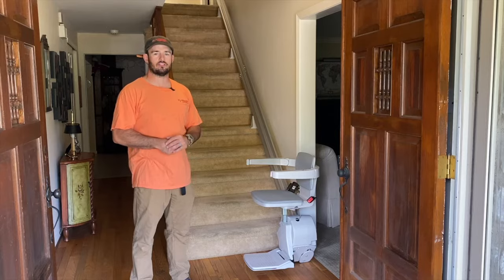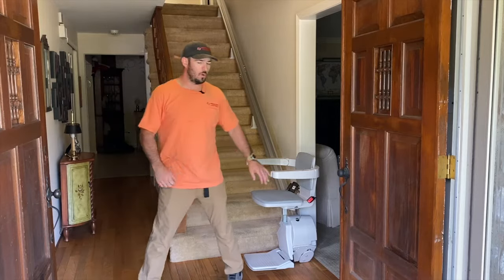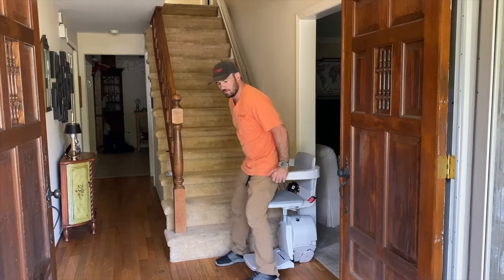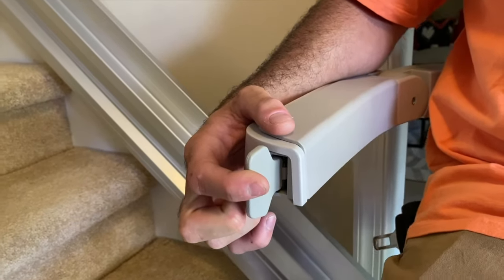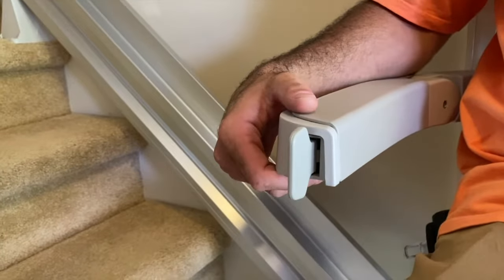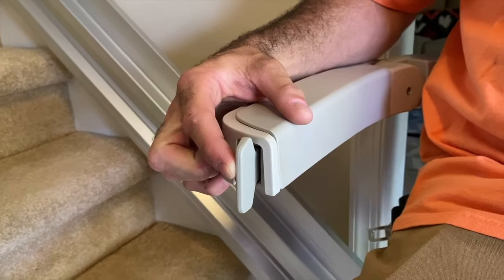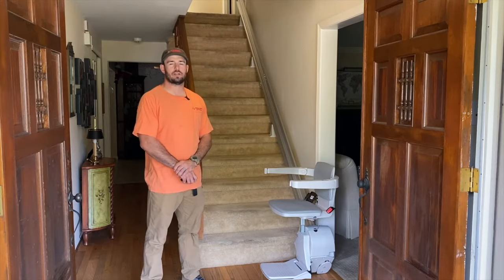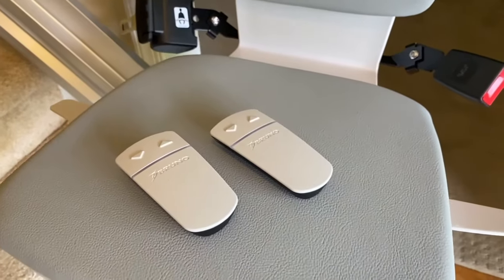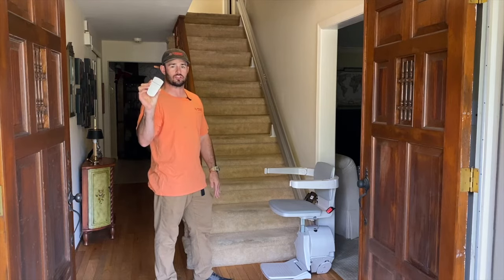One of the most common questions we get about stair lifts is how they operate. They are very simple and easy to use. Once the user backs into the chair, there is a control on the right-hand side that is directional — press up and you start to travel up; let go at any point and it stops. Press the button down and you go down. The chair will slow down, wait for the beep, and automatically stop itself. In cases where stair lifts are intended for multiple users, there are wireless remotes — one at the top and one at the bottom — allowing the user to control the stair lift from either location.